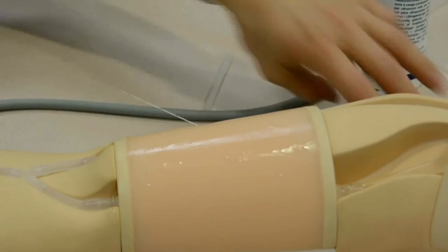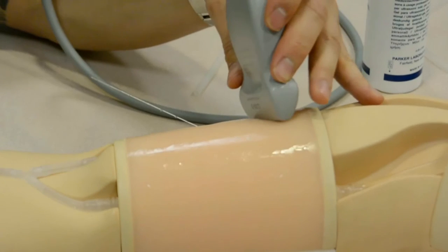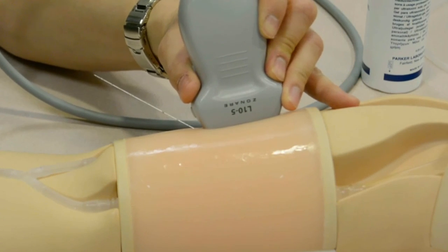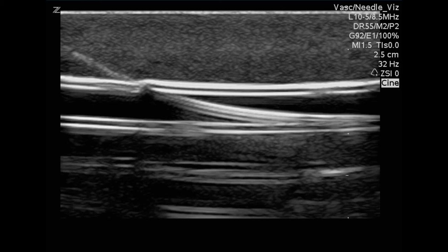Once the wire is in — shown here with the micropuncture wire — I will usually image the wire in transverse and sagittal planes just to confirm it is in the correct vessel without puncture of the posterior wall, because this is sort of the point of no return. Once you confirm the wire in place, you see the wire going through the anterior wall and layering against the back wall — it's now safe to dilate and upscale. With the wire in place, we thread the catheter over the wire in the phantom without much difficulty.